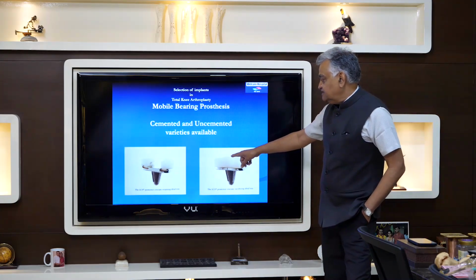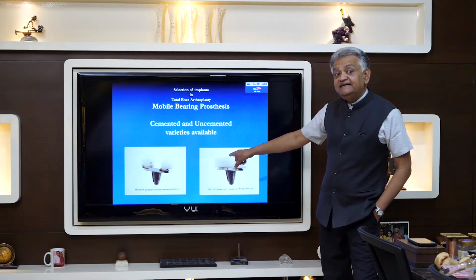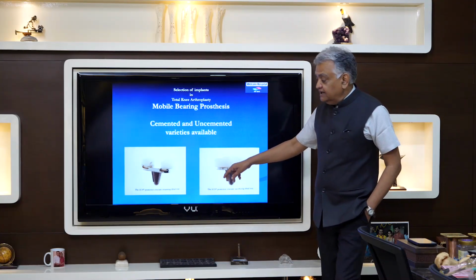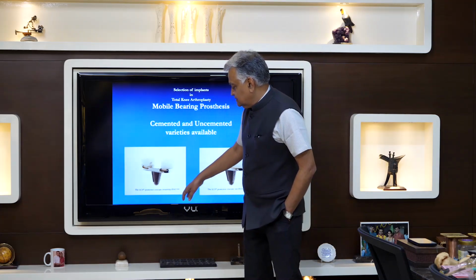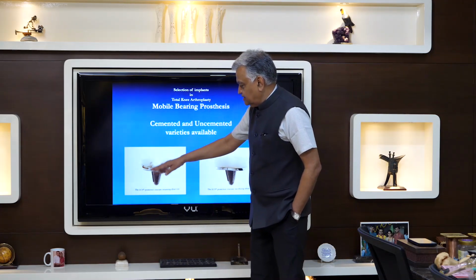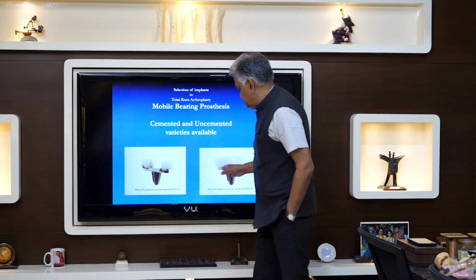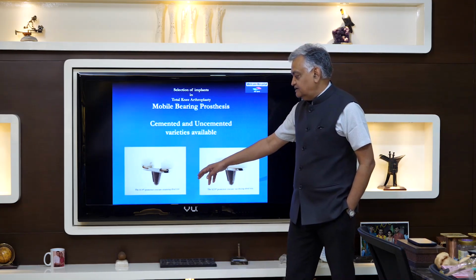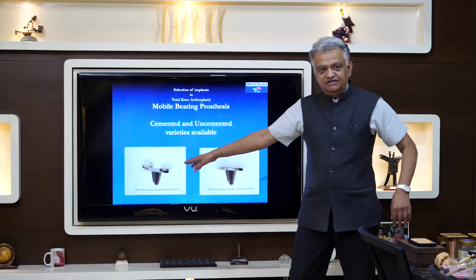And as you can see, this is a cruciate retaining design. There is no bump here. You also had, at a very early stage, although I have never used this, I have used these a few, the posterior cruciate retaining, but of a very strange looking design.